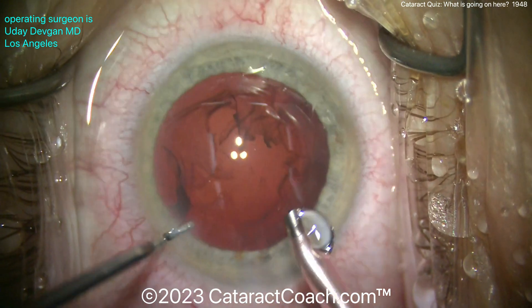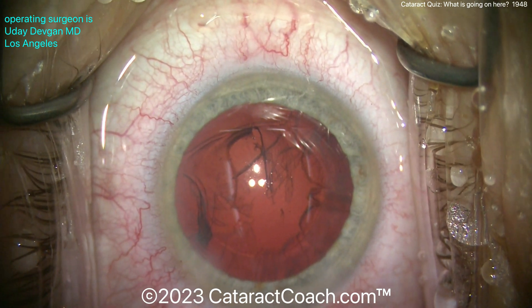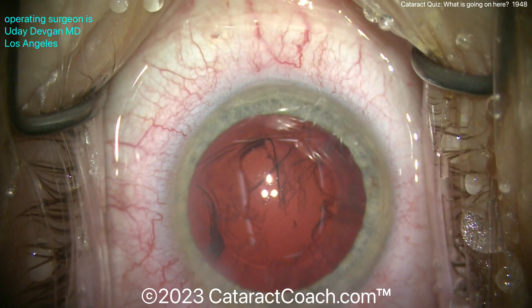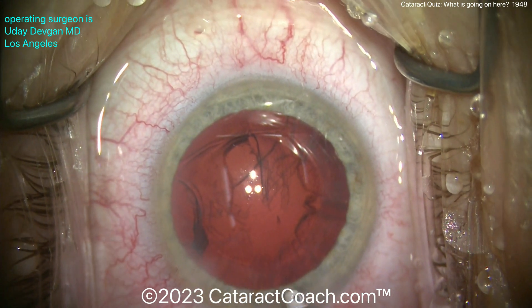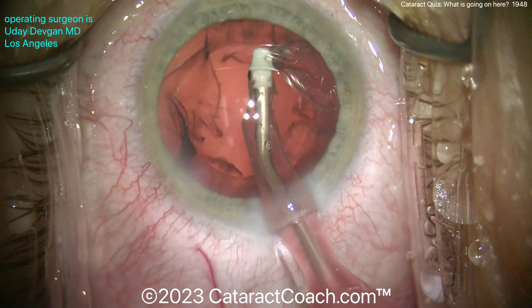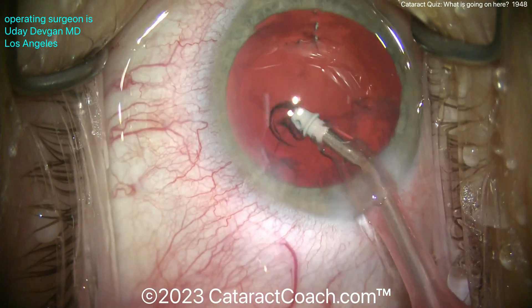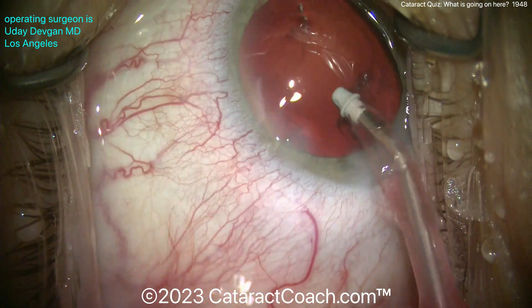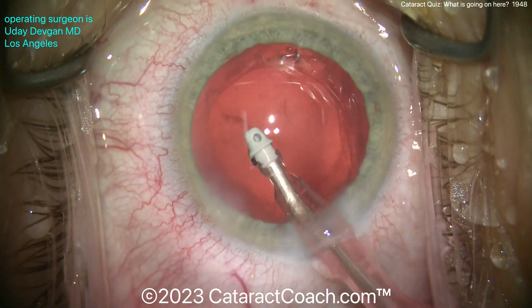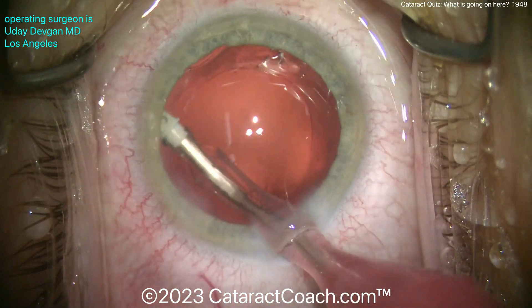Then I come out of the eye — there's the last little tiny piece — and now I notice something. Wait a minute. At the top of your screen, the patient's nasal aspect — what is that line? That's what's bothering me. I'm not so sure — maybe I shouldn't have pulled out of the eye. Going in with the phaco probe again, a little cautious about that one area. You know what? I think it's just cortex. And now you can tell for sure because look — there are some lens epithelial cells on the undersurface of the anterior lens capsule, especially superiorly. That tells me that's where the capsule is.